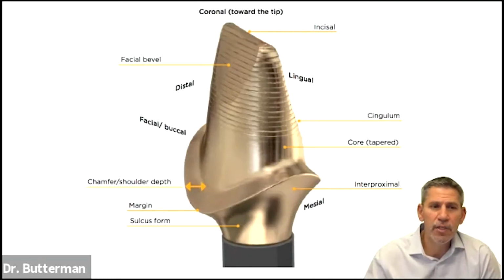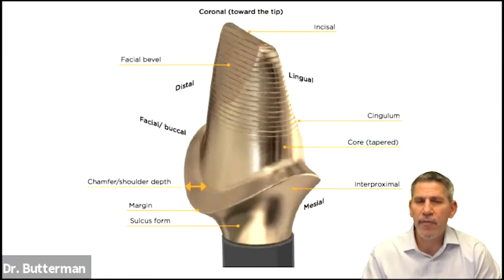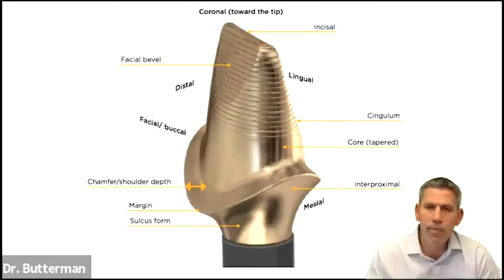First question: do you routinely charge for a 3D scan for implant placement? Yeah, really good question. In my office, a full series of X-rays is a 3D scan and 4 bitewings. I know there are offices that get a full fee for a 3D image. For me, I would give this stuff away all day long because of the treatment that I get on top of it. I don't want it to be a roadblock when I'm just starting to evaluate for implant placement. So I'll typically charge my normal full series fee or a Panorex fee when I'm doing a cone beam X-ray.